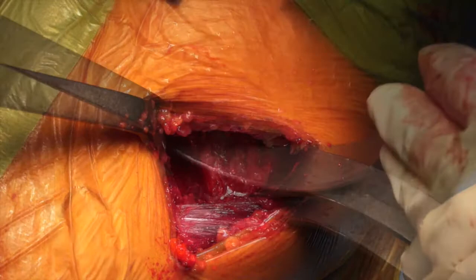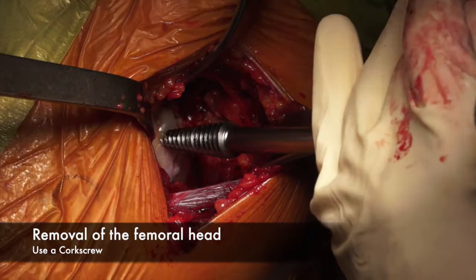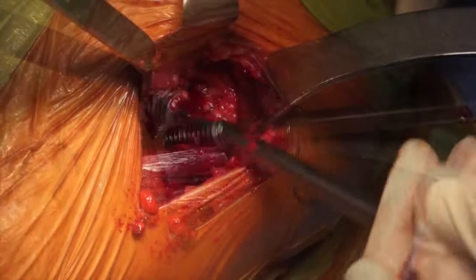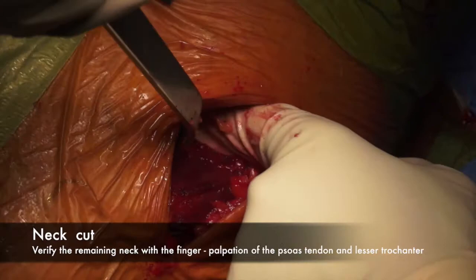Removal of the femoral head. Use a corkscrew. Verify the remaining neck with the finger. Palpation of the psoas tendon and lesser trochanter.